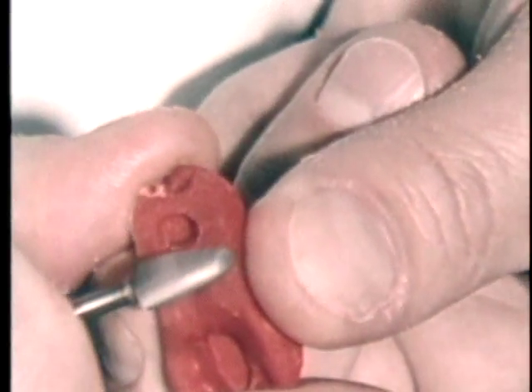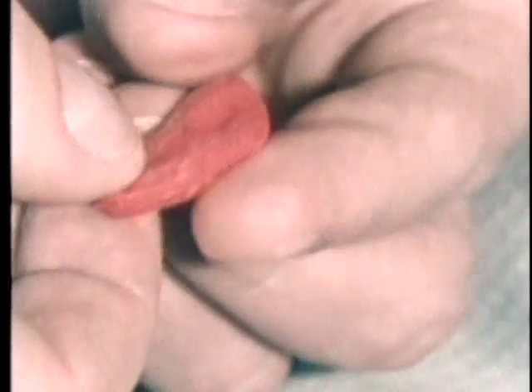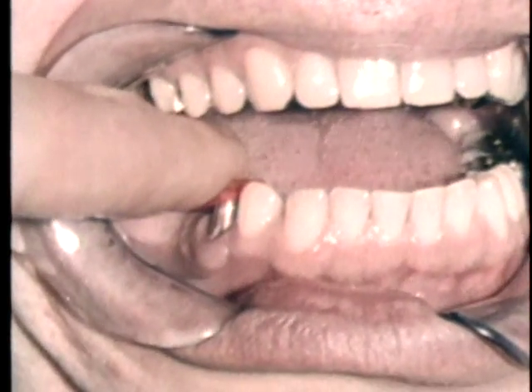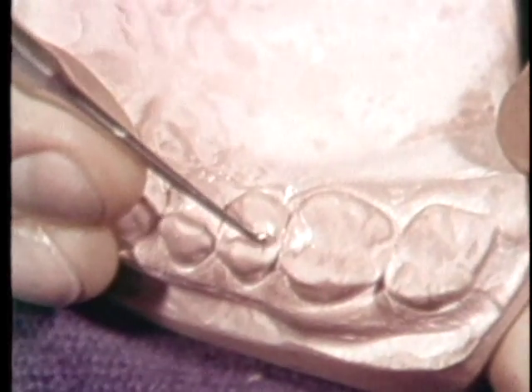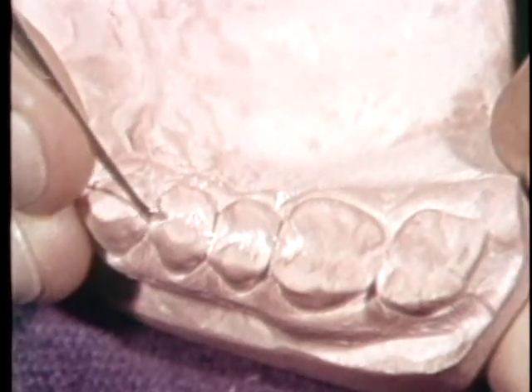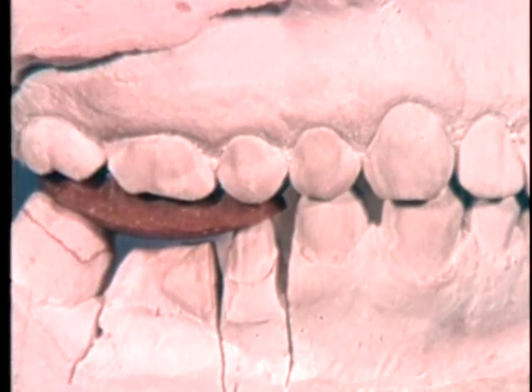The wafer is trimmed to eliminate contact with soft tissue and unprepared teeth. The finished wafer should retain only the cusp tips of opposing teeth and minimal registration of the abutments. The record is returned to the mouth and the registration verified. Prior to articulation, the cast must be free of bubbles and defects which would prevent complete seating of the registration. It must be emphasized that a recording of this type encompasses both abutments and is far more stable and easier to orient than one which involves only one of two or more abutments.